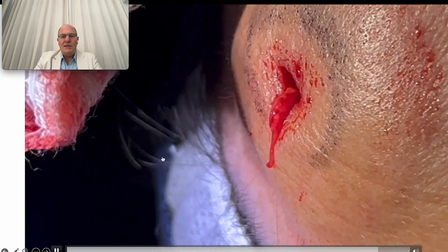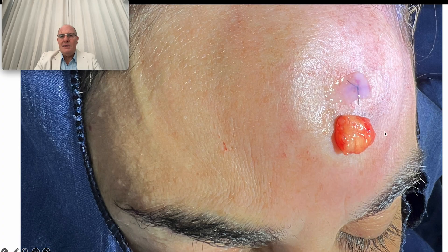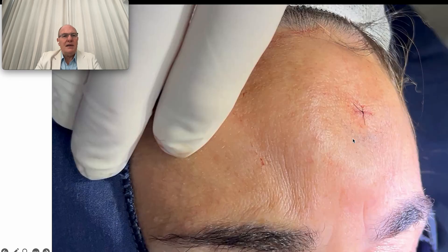You can see no bleeding at all, and here is the small incision, the tumor, and the result.